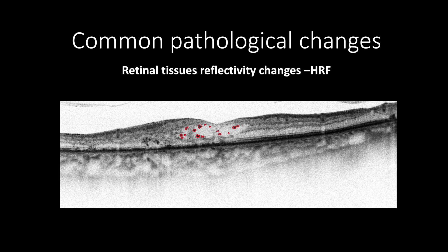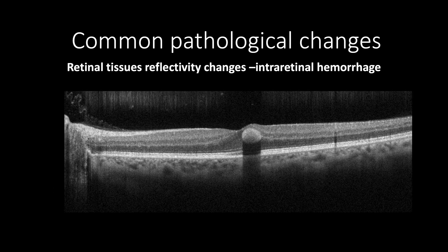Please note that in negative black and white cross-section, the disruption of the ellipsoid zone and external limiting membrane are seen more clearly. Intraretinal hemorrhage will appear as homogeneous hyperreflective with a smooth regular border.